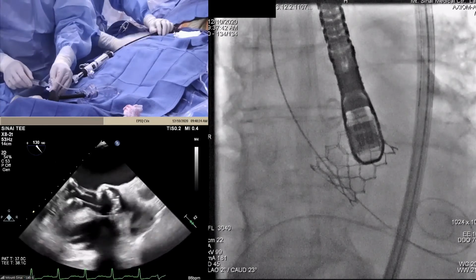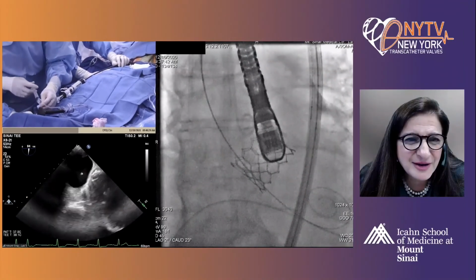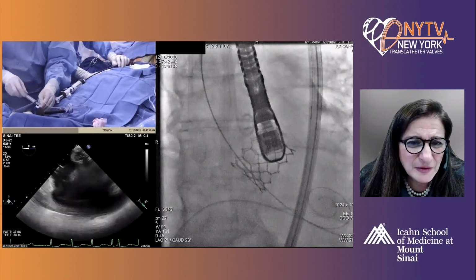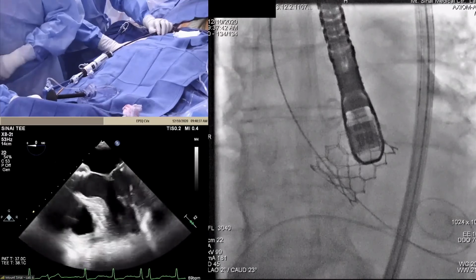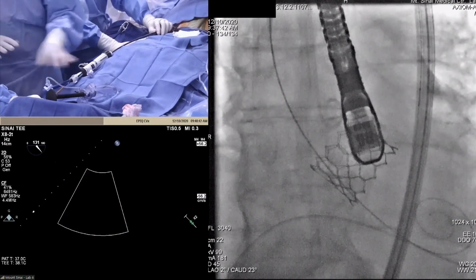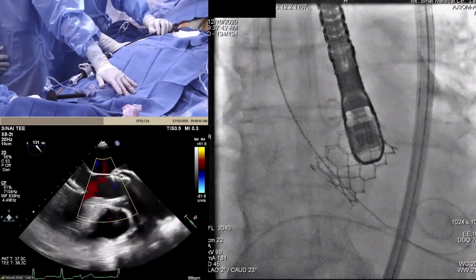There's a little bit of, it's not severe. It's like mild to moderate, maybe. Mild, I would say. Is it moderate? Yeah, mild. Can we see the main jet? You want to bring the echo on the screen and just analyze? Okay, this is good. Yes, this is good. You can see it. Just show us the jet. Can you explain, please?